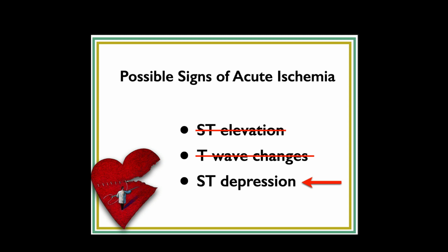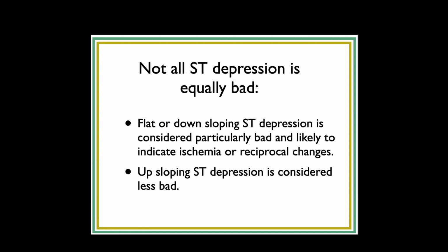But the reason for this was when we went through this before, it was from the viewpoint of there's a STEMI, how do these things relate to a STEMI? And now we're going to say, well, even if there's not a STEMI, do we need to look out for T wave changes and ST depression? So that just involves some repetition. I don't think that's necessarily a bad thing.